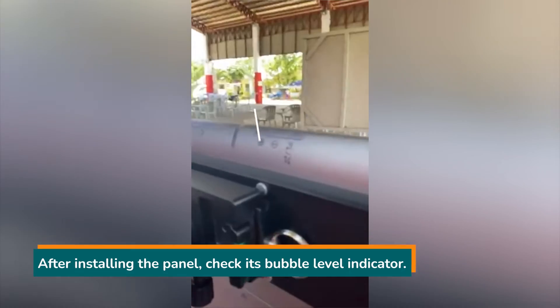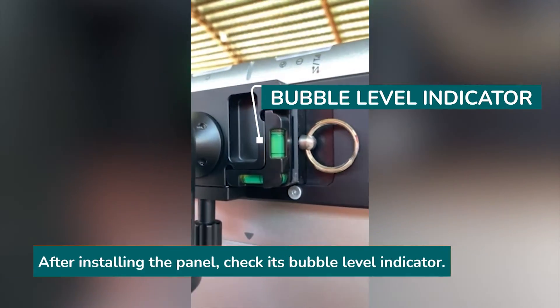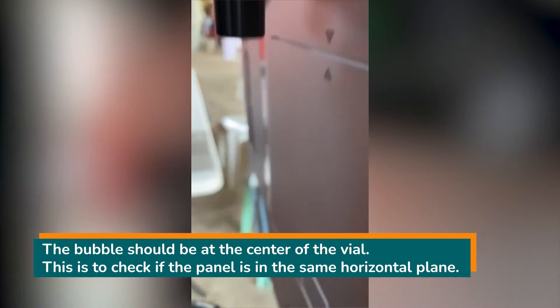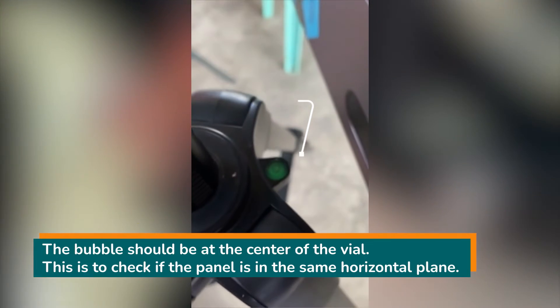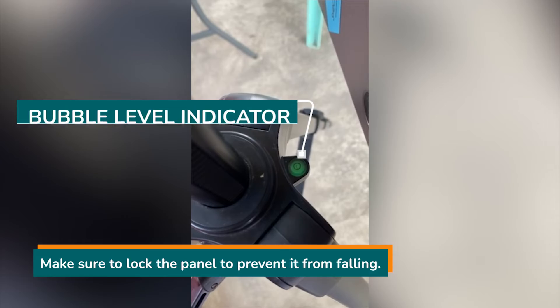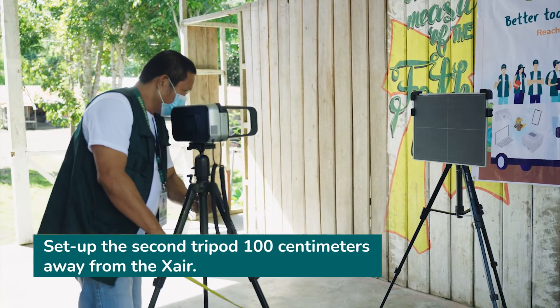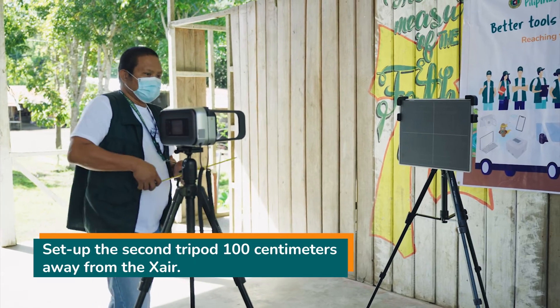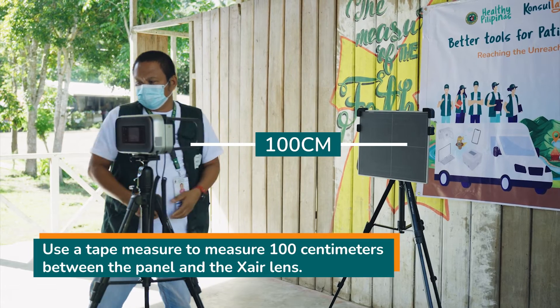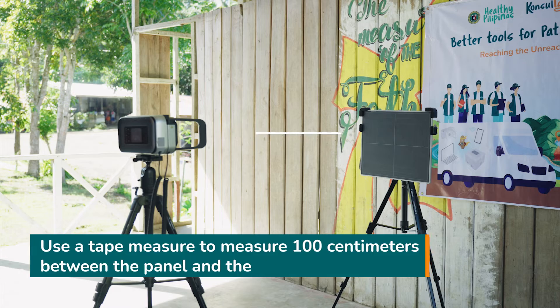Make sure to fix the flat panel sensor at 90 degrees perpendicular to the ground. After installing the panel, check the bubble level indicator located on the side of the holder. The bubble should be at the center of the vial. This is to check if the panel is in the same horizontal plane. Make sure to lock the panel to prevent it from falling. Set up the second tripod 100 centimeters away from the X-ray. Use a tape measure to measure 100 centimeters from the front of the panel to the front tip of the X-ray lens.